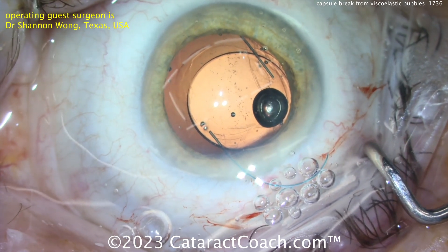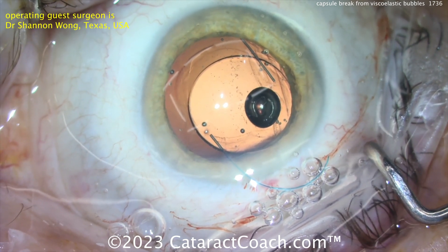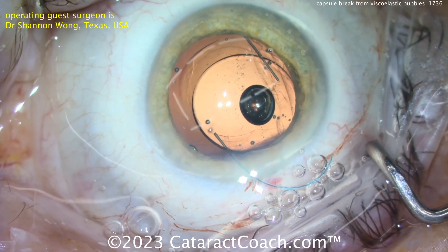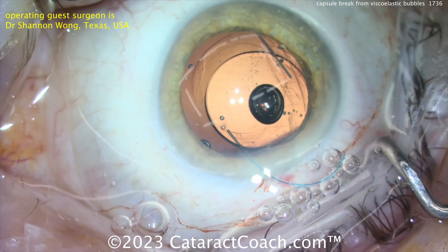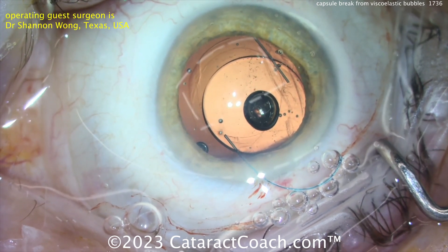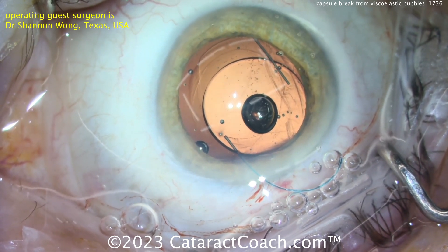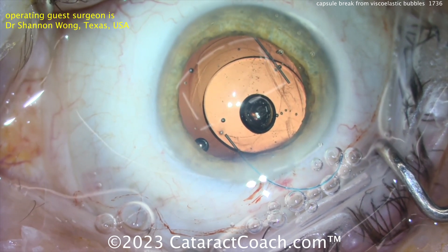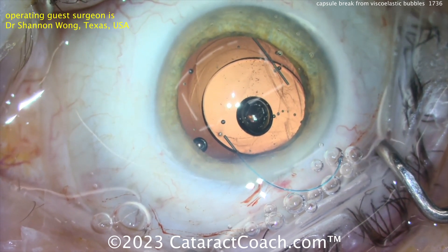Dr. Wong said it was the OcuCoat brand of HPMC — a dispersive viscoelastic derived from plant-based cellulose material. It has the advantage of being very dispersive, can coat the cornea, and is relatively inexpensive, coming in a full one-cc vial. However, as seen in these two cases, bubbles in the viscoelastic can, with enough force when expelled, actually rip open the posterior capsule.